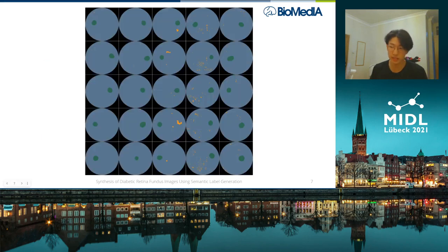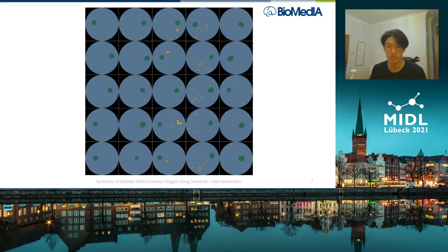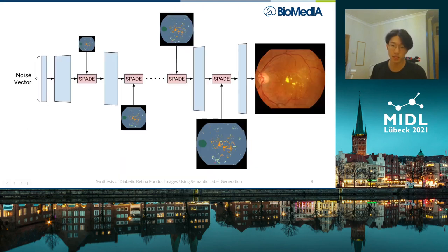You can see here the result of this network. In this example, each column represents a DR severity grade from 0 to 4. You can see that the conditioning has worked relatively well, with lesions being more prominent in the higher DR grades. From these, we actually pass them to the SPADE image-to-image translation network in order to synthesize realistic retinal fundus images from these semantic labels.